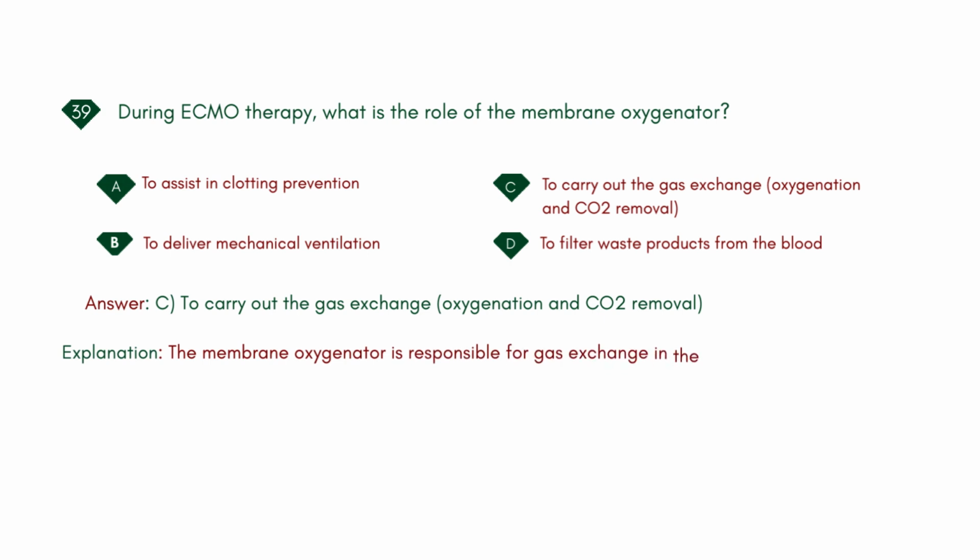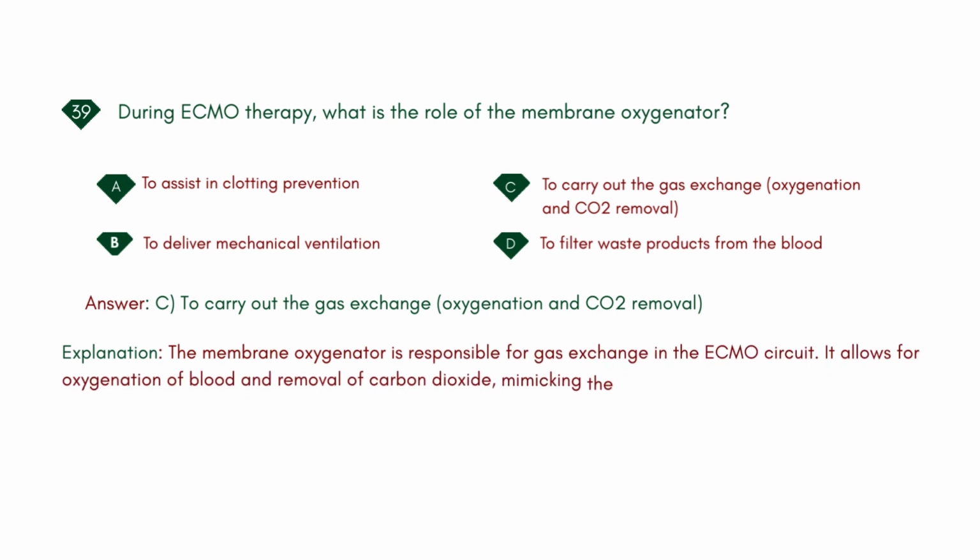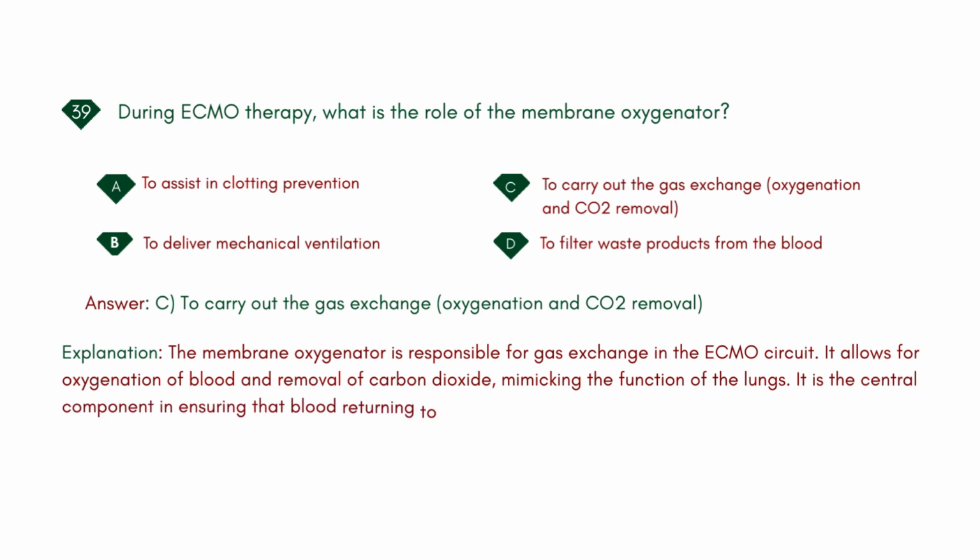Explanation: the membrane oxygenator is responsible for gas exchange in the ECMO circuit. It allows for oxygenation of blood and removal of carbon dioxide, mimicking the function of the lungs. It is the central component in ensuring that blood returning to the body is properly oxygenated.